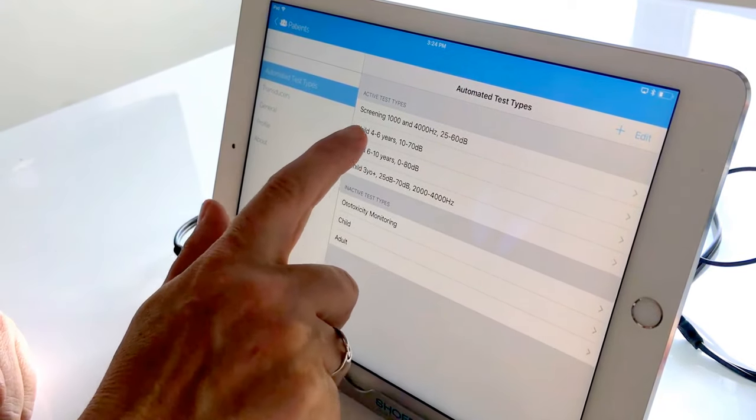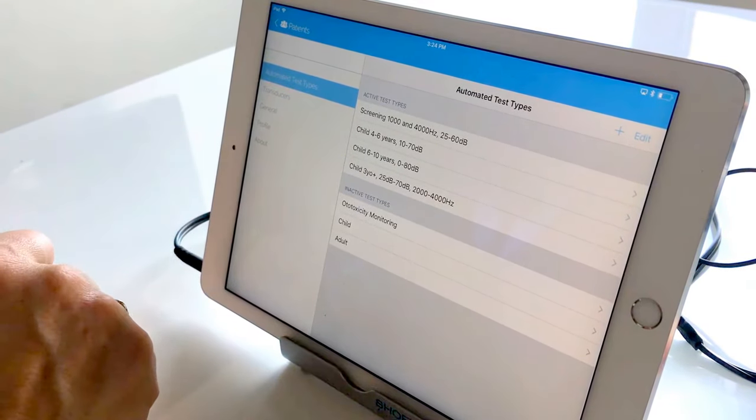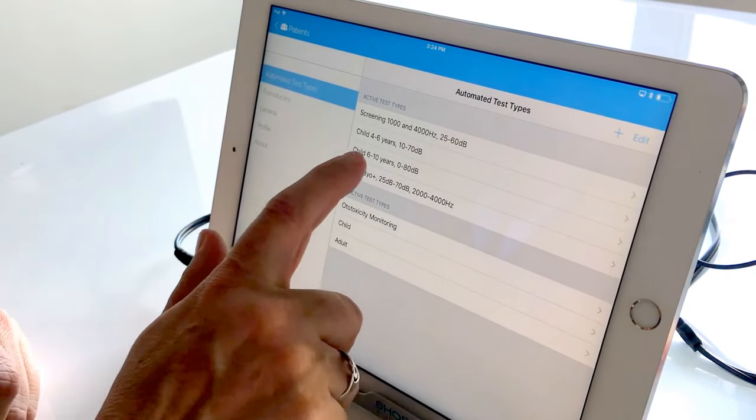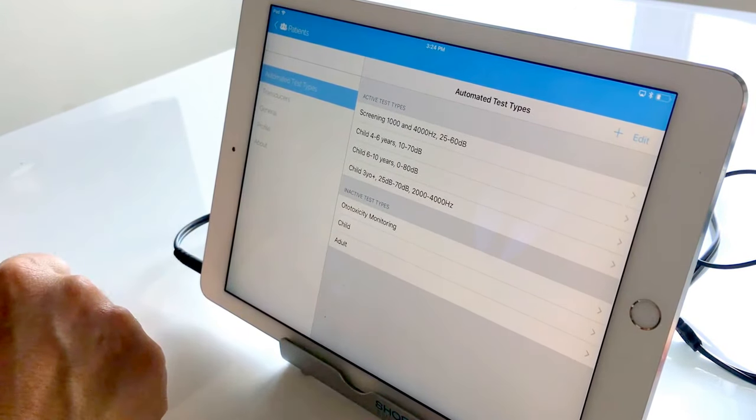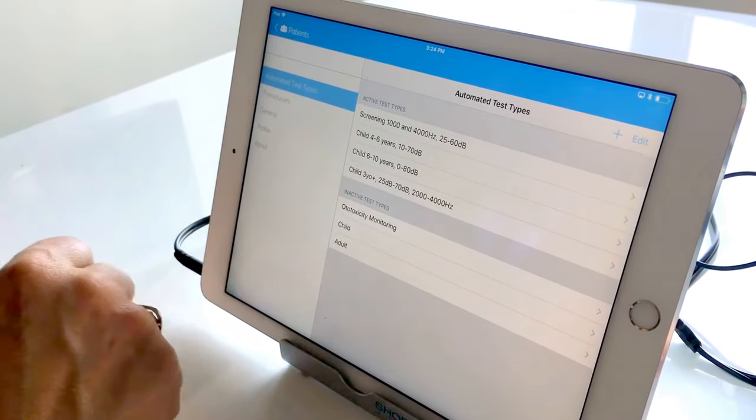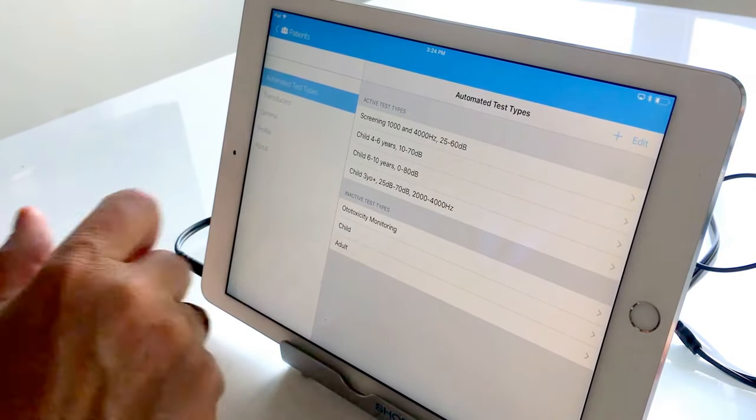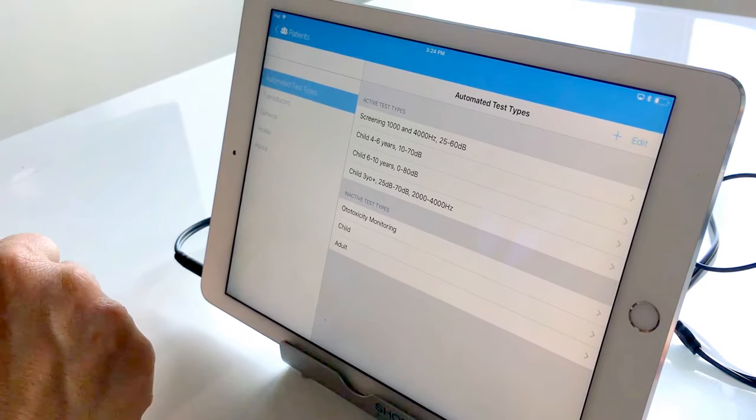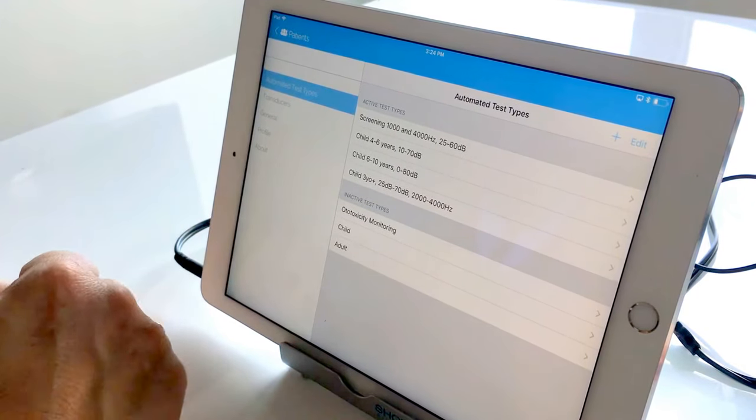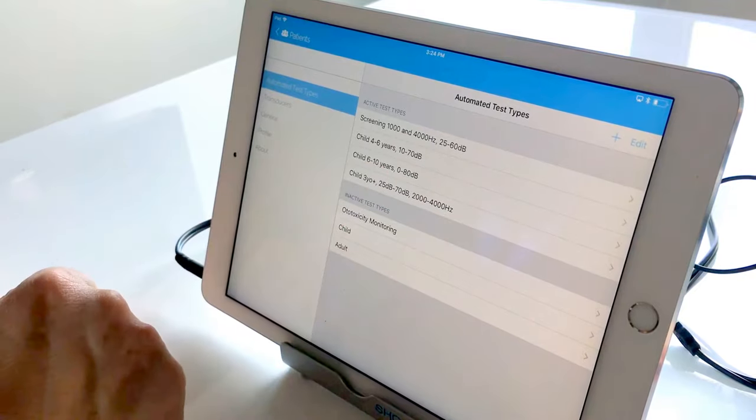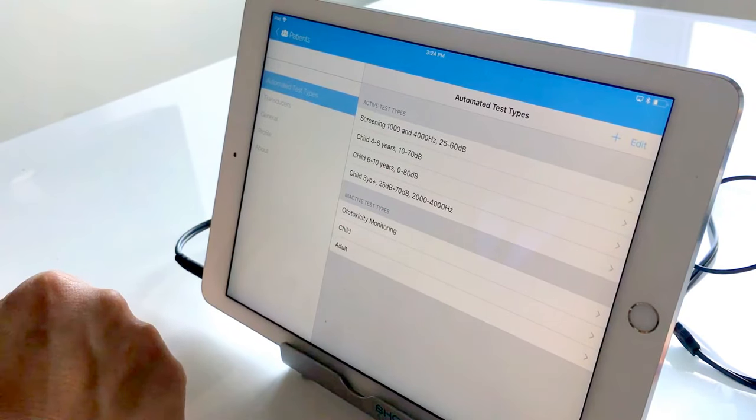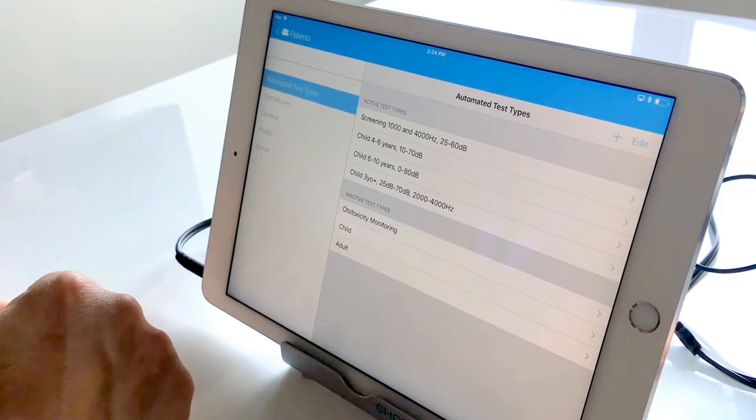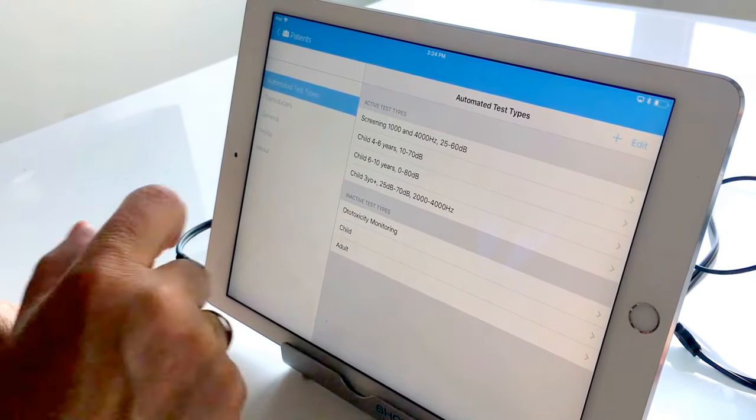I have one here for children four to six years old with a reduced range. You'll see here for children six to ten years old that I've increased that range. One because they're better able to go down to threshold and therefore at zero decibels would capture more thresholds than stopping at ten. But you would also need to be in a quieter environment than a relatively loud waiting room for example or side room of a pediatric clinic.